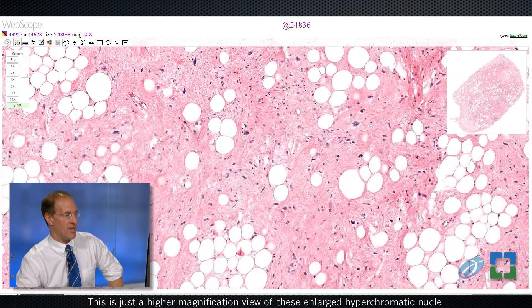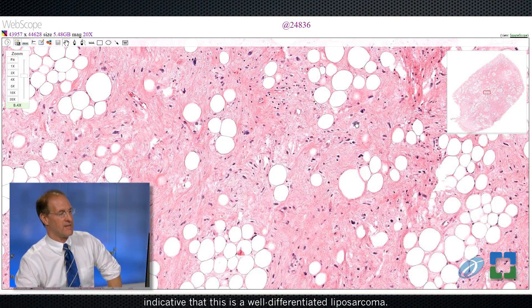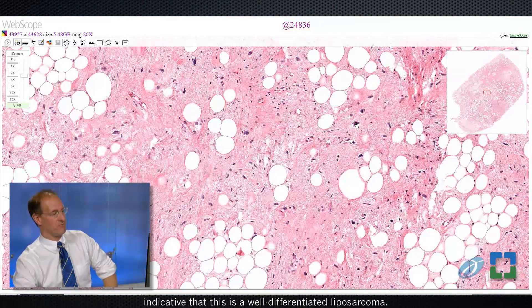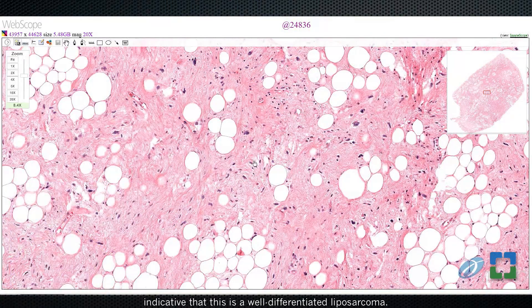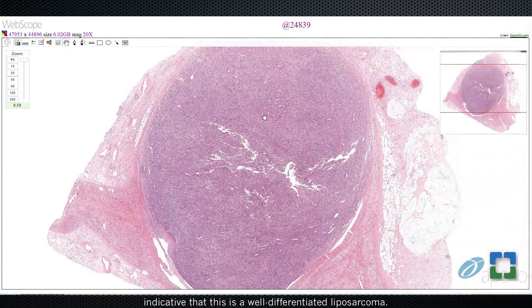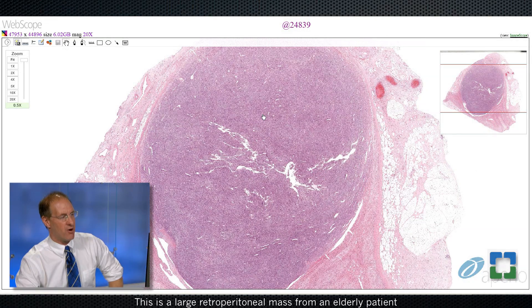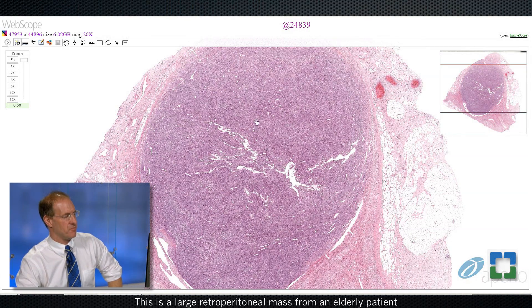This is just a higher magnification view of these enlarged hyperchromatic nuclei, indicative that this is a well-differentiated liposarcoma. This brings us to the final case — a large retroperitoneal mass from an elderly patient.